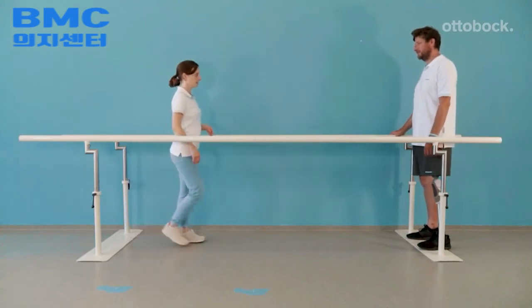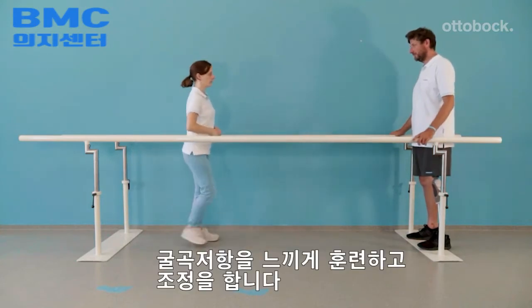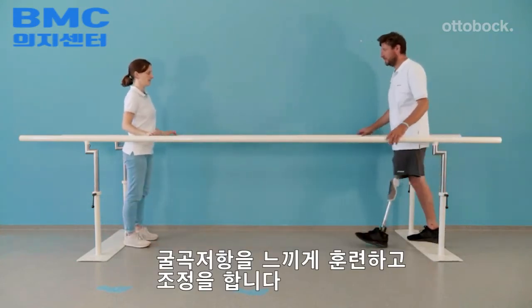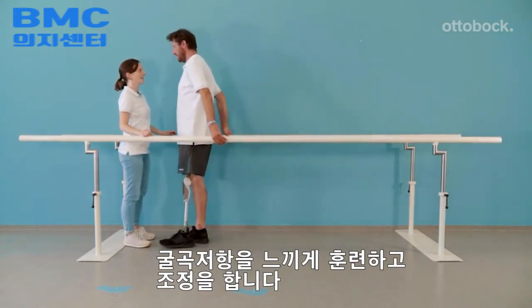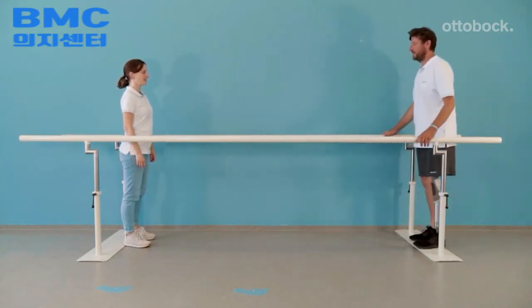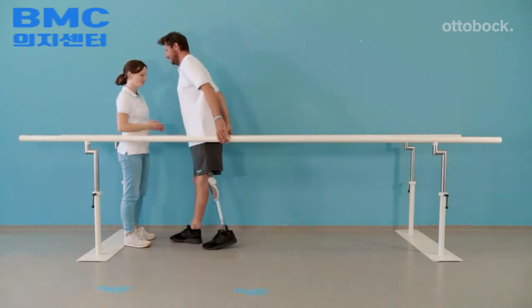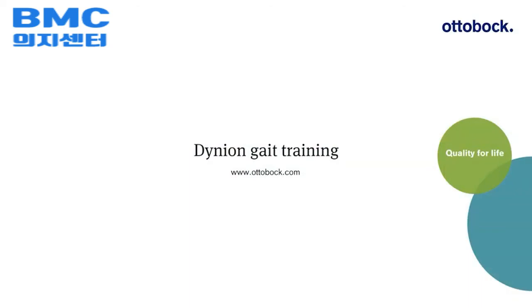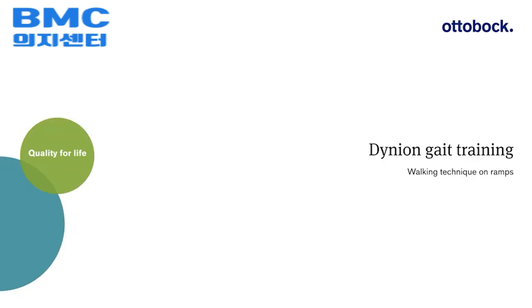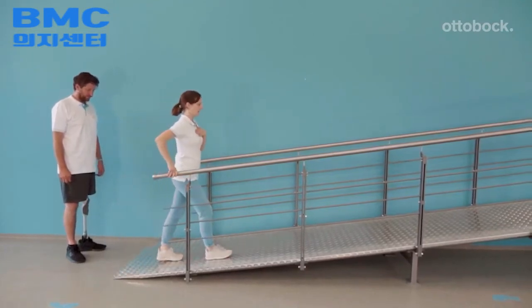In this exercise, the model learns how to slow down using the yielding technique to relieve the contralateral side. When practicing without holding on to the parallel bars, the amount of yielding is determined by his ability to bring the knee into extension. When walking uphill, the model makes sure he is initiating swing phase by using the hip flexor muscles.